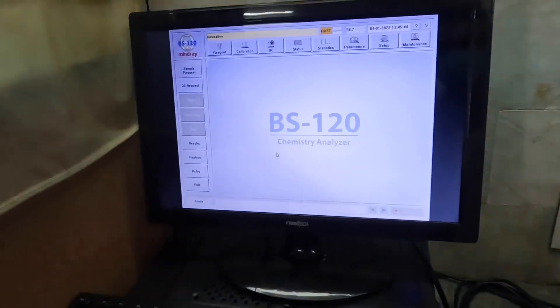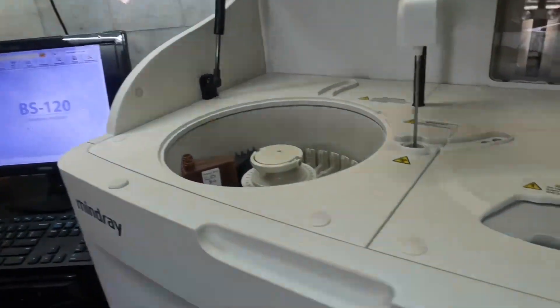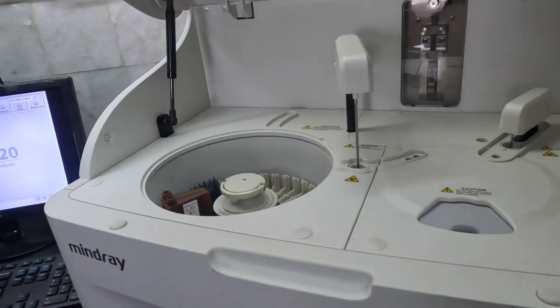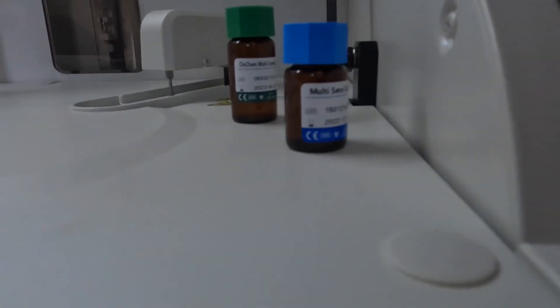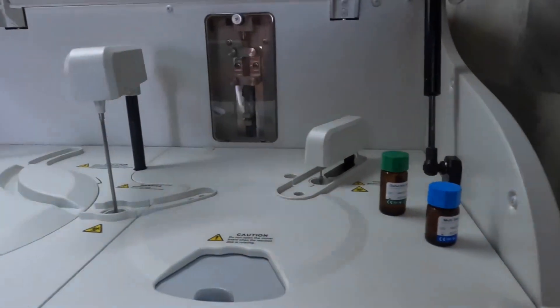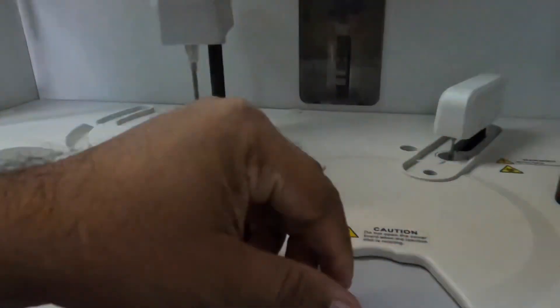This is the software as it appears after installation. This is the BS120 Mindray machine which we have installed in this diagnostic center, and this is the complete process. We also procured some reagents for the laboratory for the initial days, such as glucose and total cholesterol, and in that corner we have also got a multi-sera calibrator for the center.